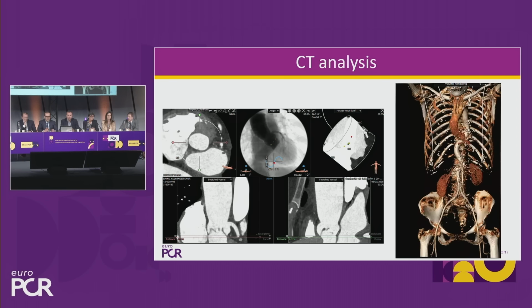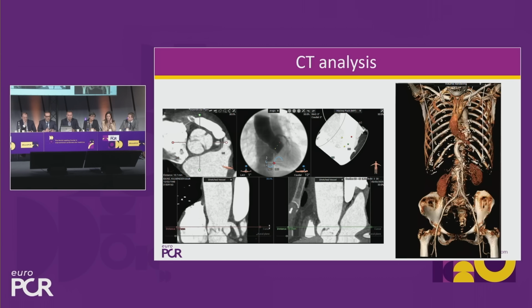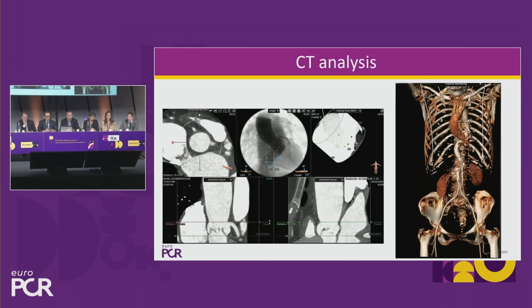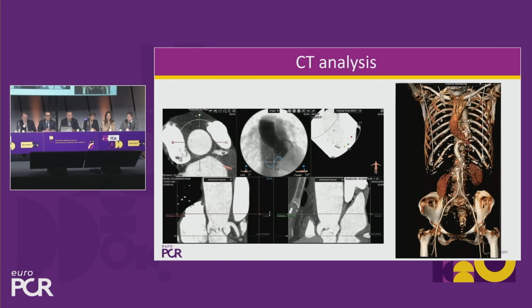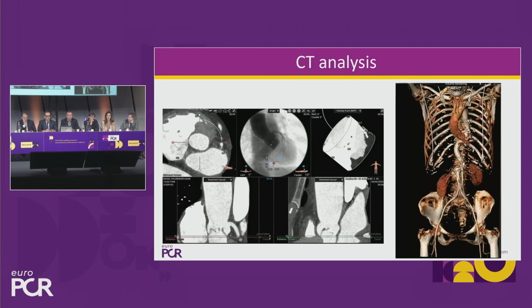If there is severe calcification, I would maybe rather opt for a smaller device. Also about LVOT diameter, maybe. If you have an LVOT that flares, you may be happy to implant also a larger rather than a smaller valve. It's about diameter of the sinus of the ascending aorta, maybe about ellipticity. So I think there are several parameters that we can factor in this decision.